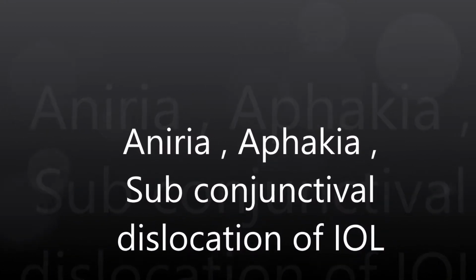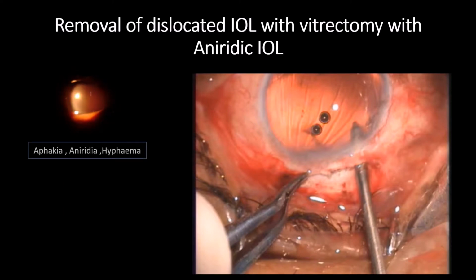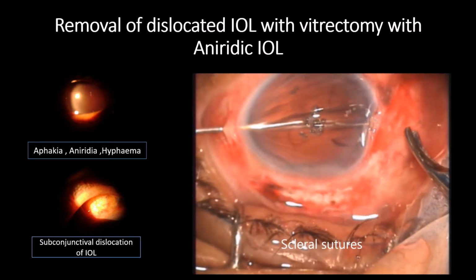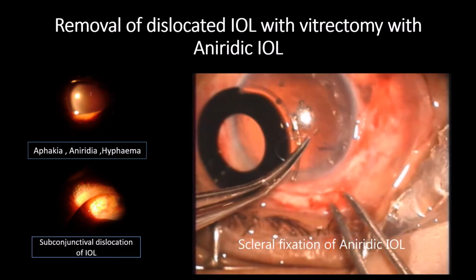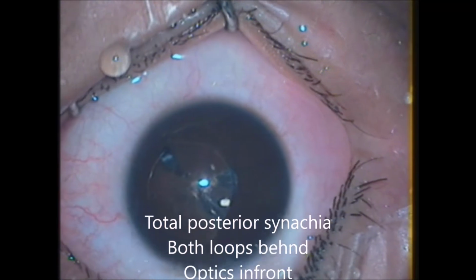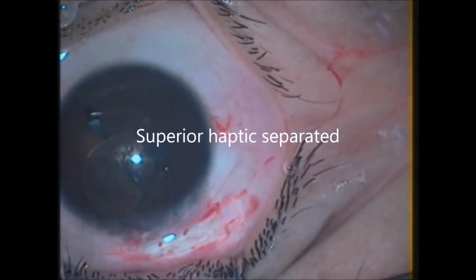In trauma, one can get aniridia, aphakia, and dislocation of lens. This was a case. There was aphakia, aniridia, and total hyphema. The IOL was dislocated subconjunctivally. So this hyphema was removed with the help of vitrectomy, anterior vitrectomy. Then scleral sutures were passed, and these sutures were tied with the IOL, and this IOL could be placed near its home.